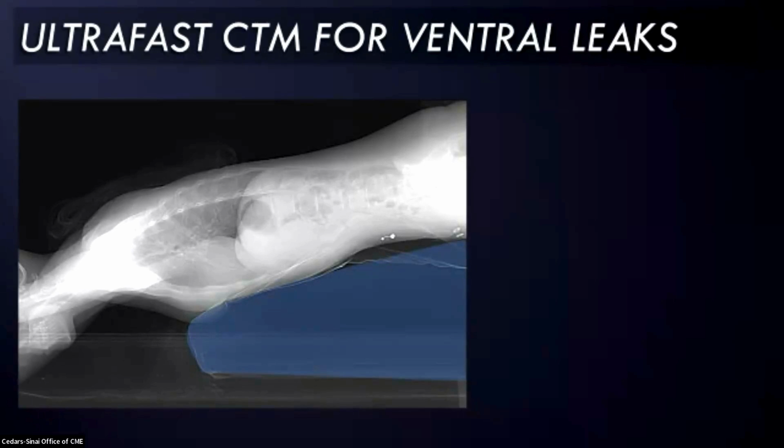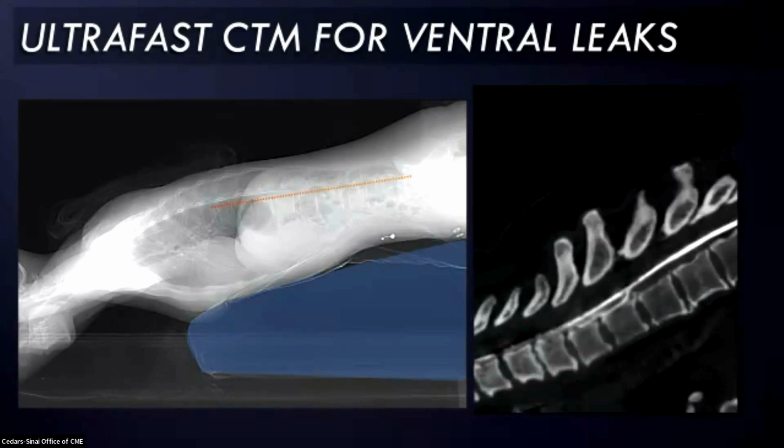And that's what will happen when you inject contrast. So it's very technique dependent. You have to make sure that the patient is sloped downwards. Otherwise, the contrast will just pool in the lower part of the spine.